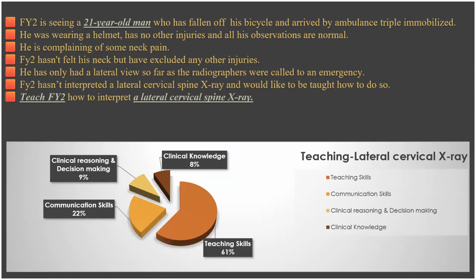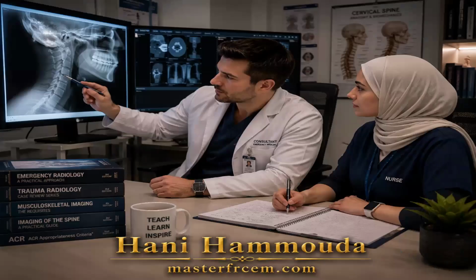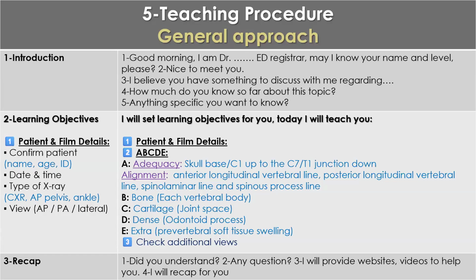Good morning. I'm Dr. Sundar, the registrar. May I know your name and level, please? Nice to meet you. I believe you have something to discuss with me regarding cervical spine X-ray interpretation. How far do you know about it? Any specific thing you want to learn? I will set learning objectives for you. We will discuss the patient's X-ray, their details, the ABCDE approach to read an X-ray, and then we will check an additional view. I will also share videos and links with you so that we can keep this learning process going.